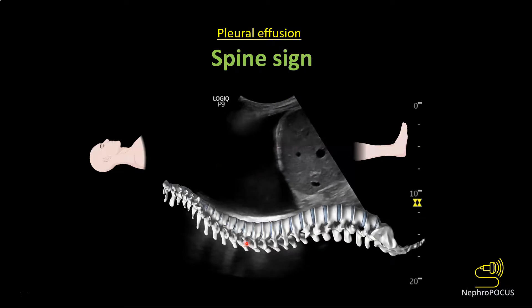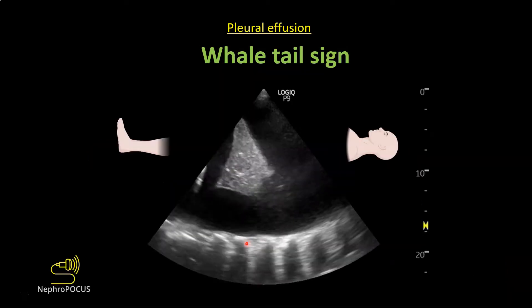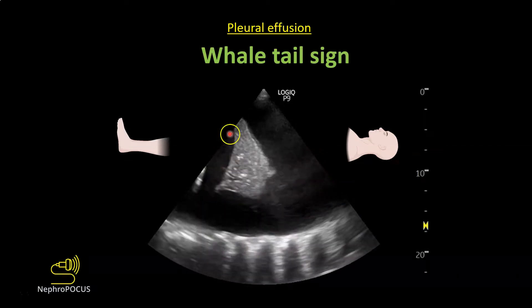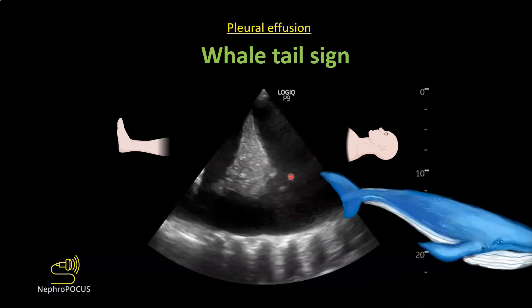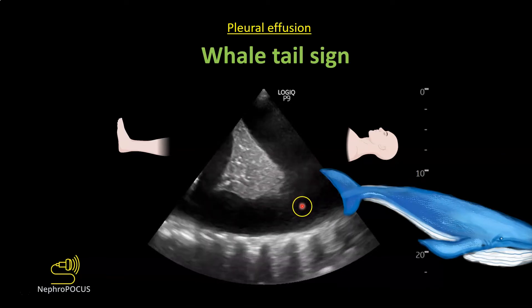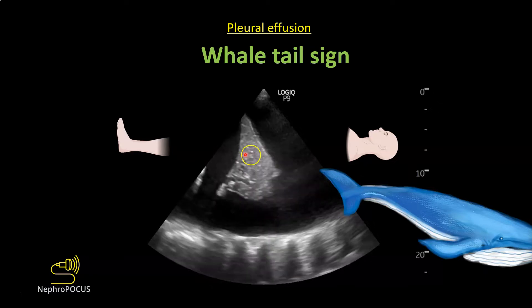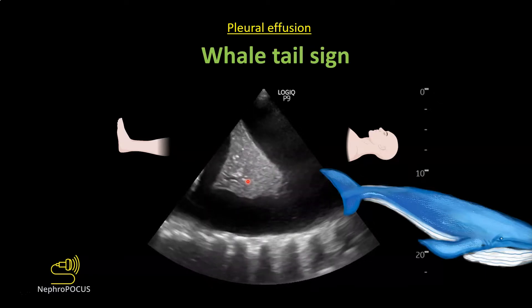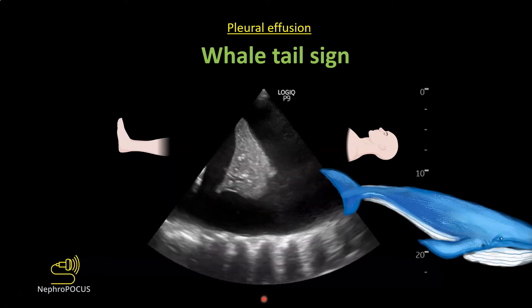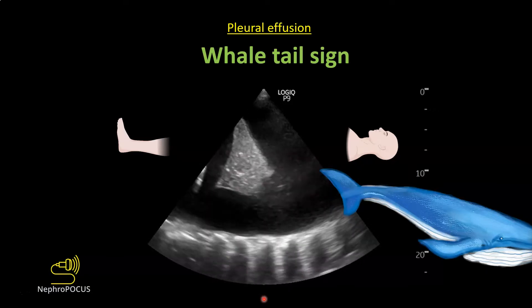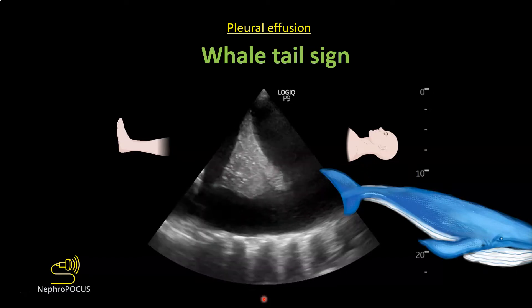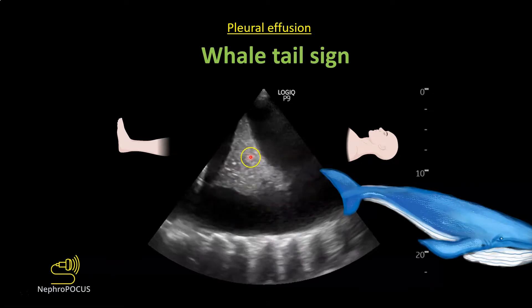This is called the spine sign or thoracic spine sign. With significant pleural effusion you will often see something floating within the effusion corresponding to atelectatic lung, because there is always some degree of compressive atelectasis with pleural effusion — this is called the whale tail sign or jellyfish sign. Note the bright pearly structures inside the atelectatic lung; these correspond to static air bronchograms. Air is white on ultrasound. These static bronchograms do not move independently with respiration even though the collapsed lung moves.